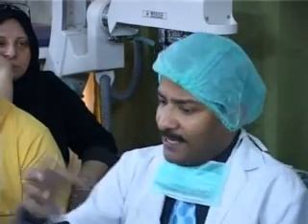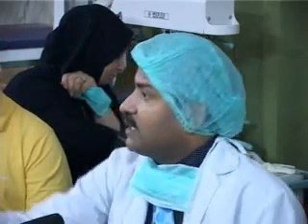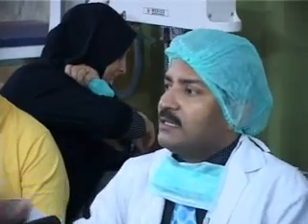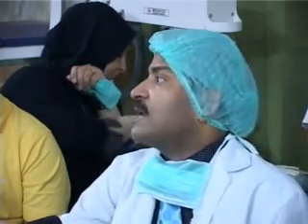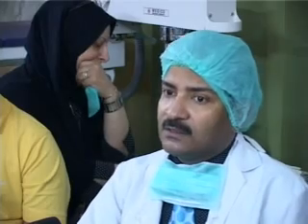Just like when you do a laparotomy and you are taking the coil of intestine outside, you are very worried that it should not dry. You take a sponge wet with saline and keep it there repeatedly, so that it stays moist. If not, it will become dry, and you get tense about why it is like that.